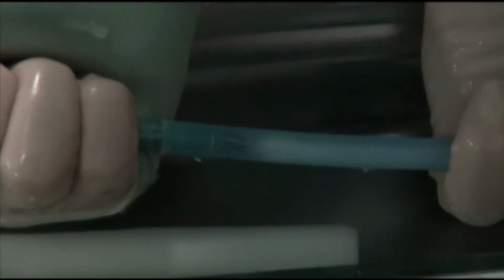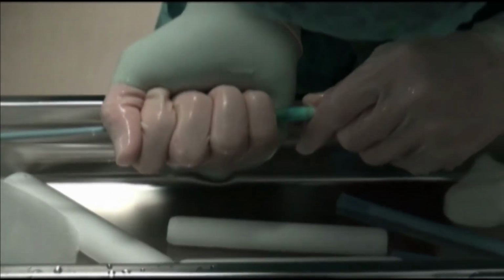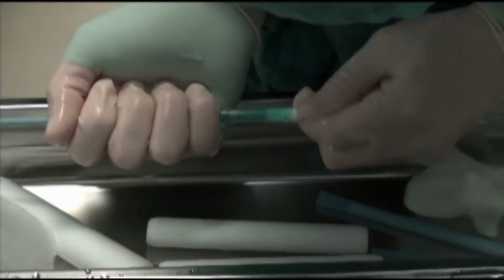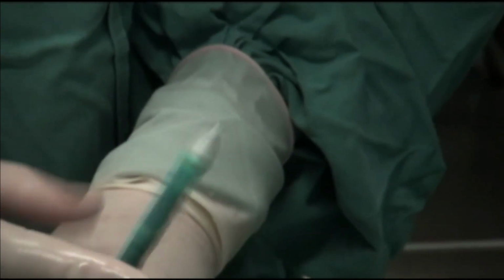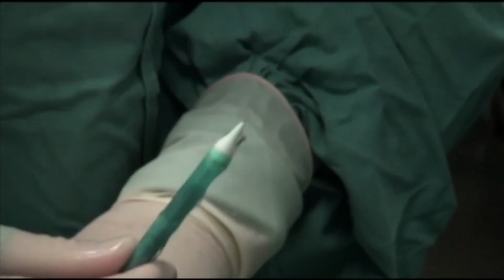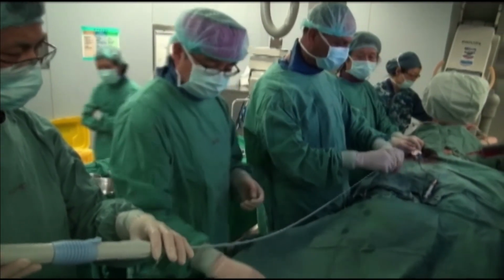So the valve touches the tip, the bullet. Then we will flush to get the air bubbles out. And you can see the delivery sheath, the tip has a circle. So under the fluoroscopic imaging, you can see the cover sheath well. Then we will release, and the cover sheath, the valve will self-expand.